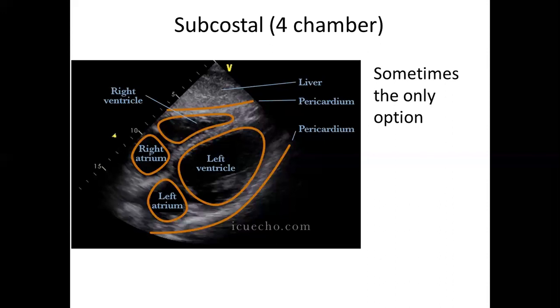Or a patient may have some severe plaques on the pleural cavity. Sometimes it also may be an issue, but not that big of an issue as emphysema or pneumothorax or narrowed intercostal spaces and rib deformities. Not like that, but it may be some issues. So sometimes the epigastric or subcostal window is the only possible window.